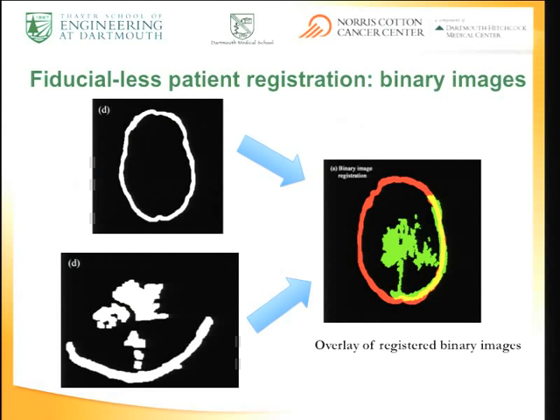One of the nice things about that 3D scan, which we never saw when we had swept 2D, was that we really do see what we call the parenchymal surface contralateral to the scan head position. That comes in very nicely, and that's kind of a fixed structure. And I'll show you later how we use that as a fixed structure that we can rely on. So it's really aided our ability to do this.